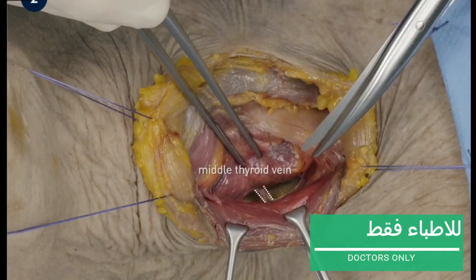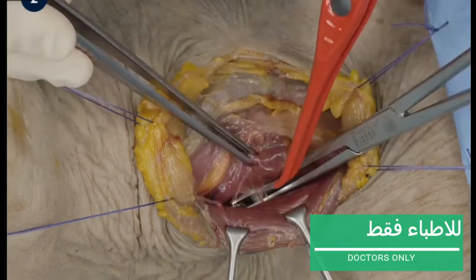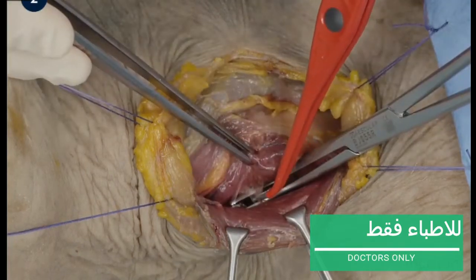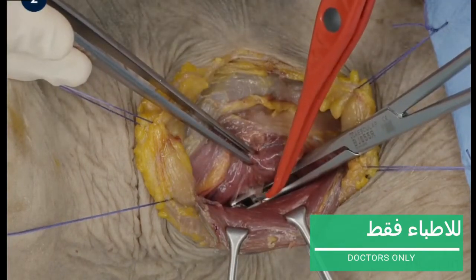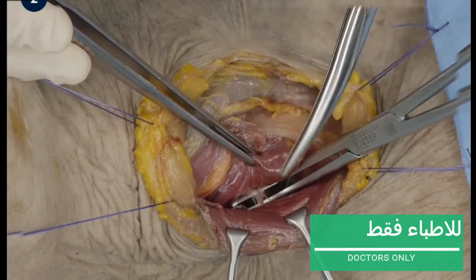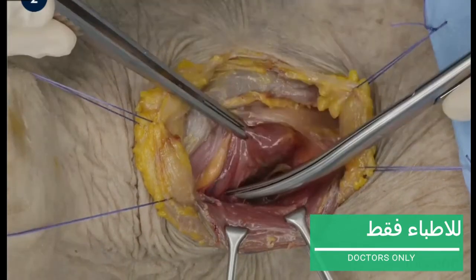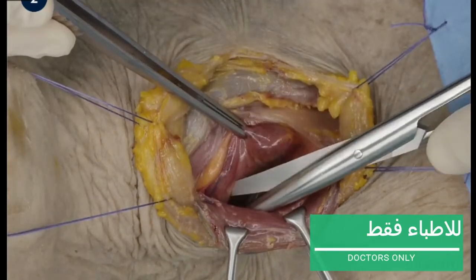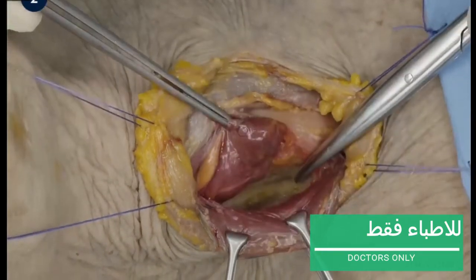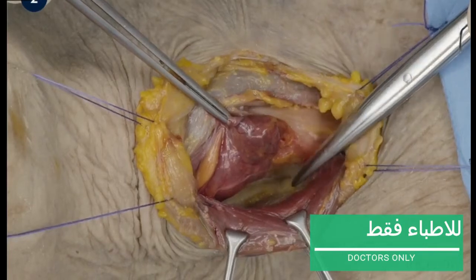This is the middle thyroid vein, which is ligated. The dissection is continued until the carotid artery, which is pointed out here.